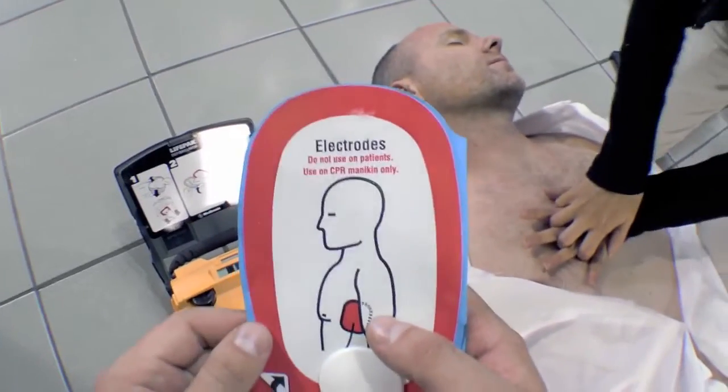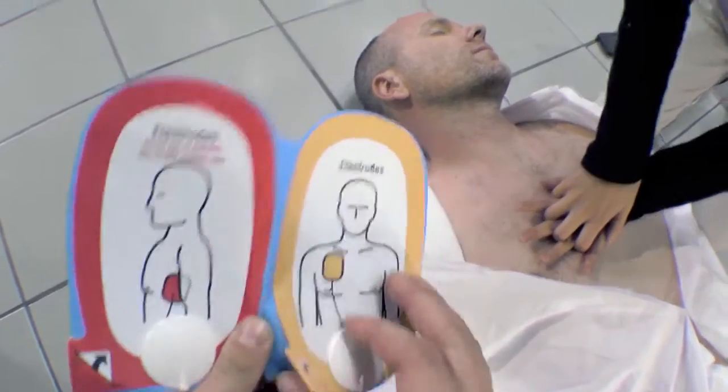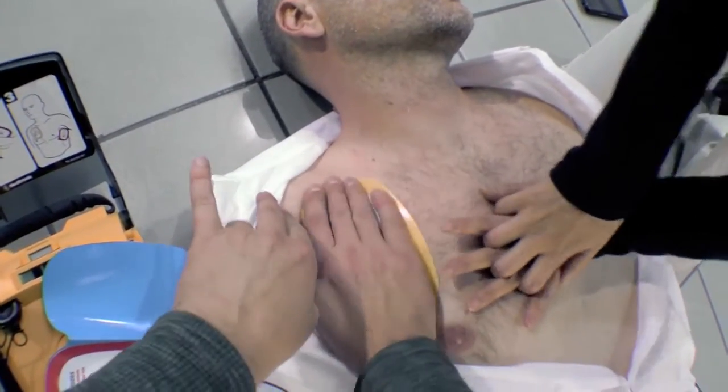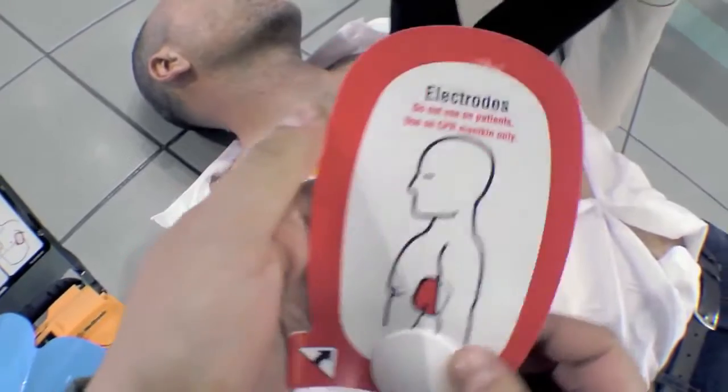Look at pictures on pads. Peel one pad off blue plastic. Apply pad to bare skin, exactly as shown in the picture. Press pad firmly. Peel other pad off blue plastic. Apply pad to bare skin, exactly as shown in the picture. Press pad firmly.